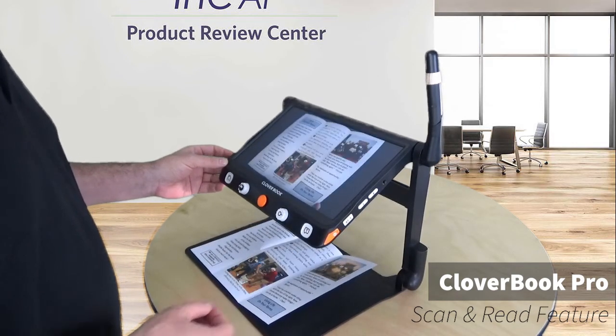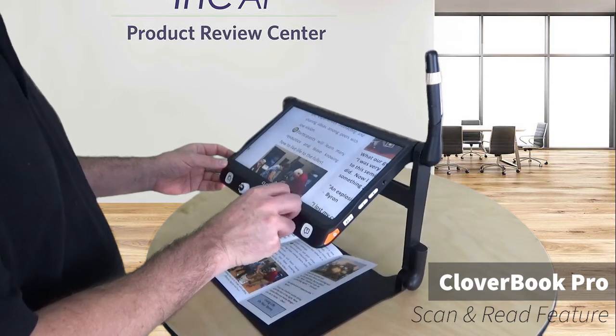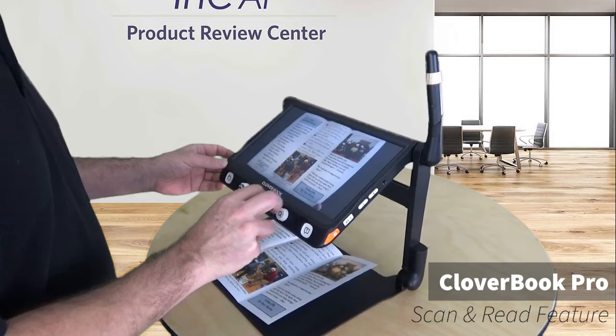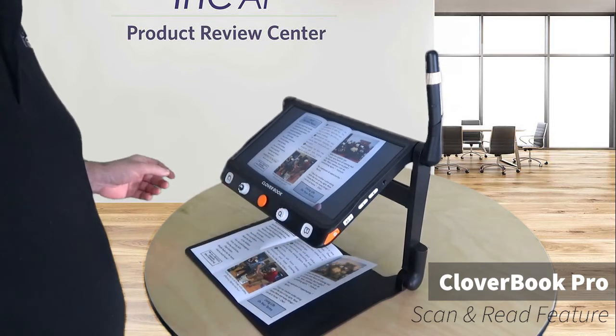And I can press that and go back to view the original document if that's what I want to read, whichever view I want to see. But I can easily just scan the entire page and have it read back to me aloud.